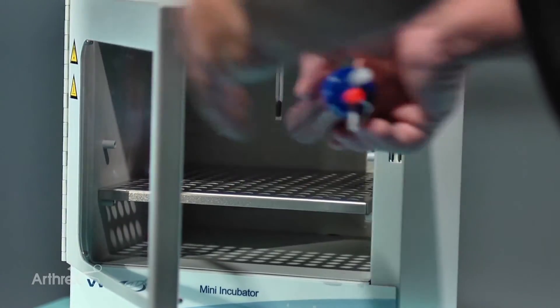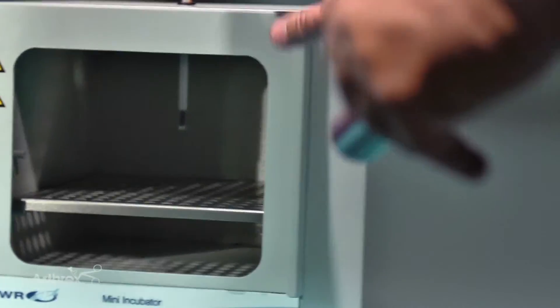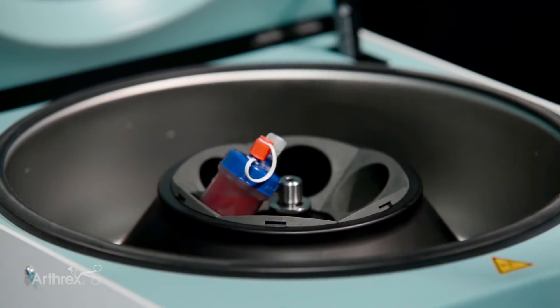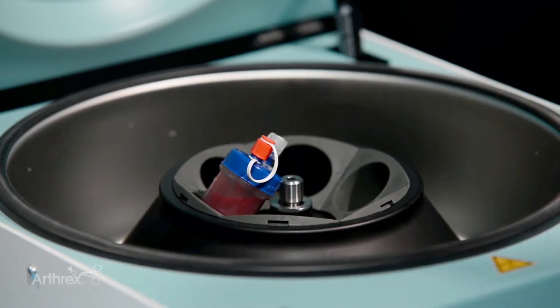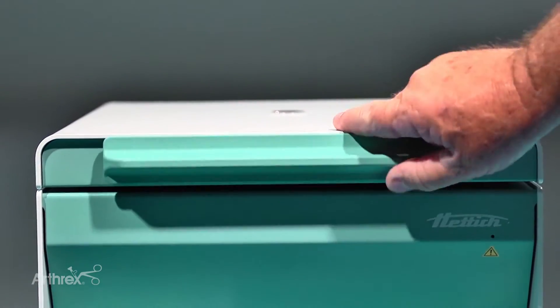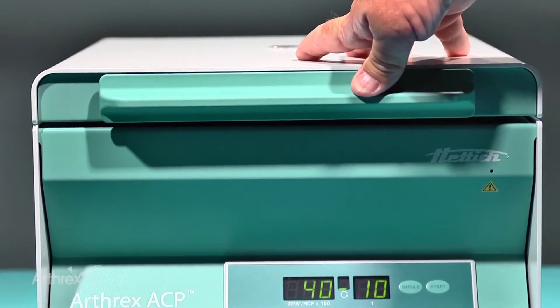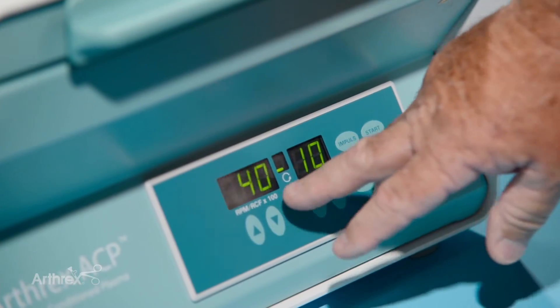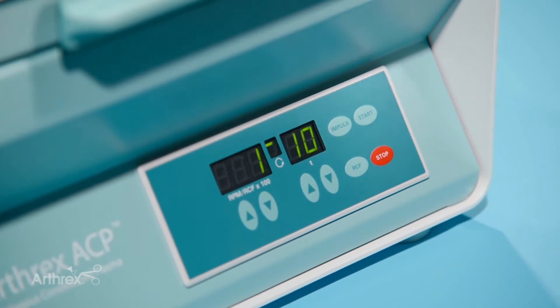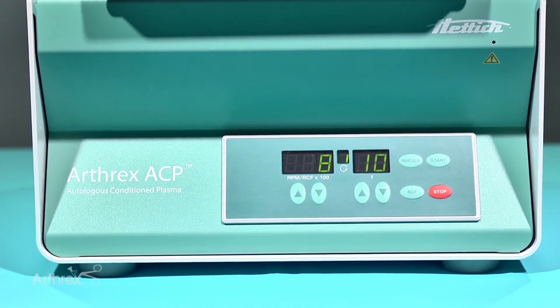After we incubate for the required time, we go into the centrifuge and place it into the IRAP rotor — we always use a counterbalance. We close it, make sure it's clipped down, and it's been preset for 4,000 RPMs at 10 minutes. Push start and our product will be ready in 10 minutes.